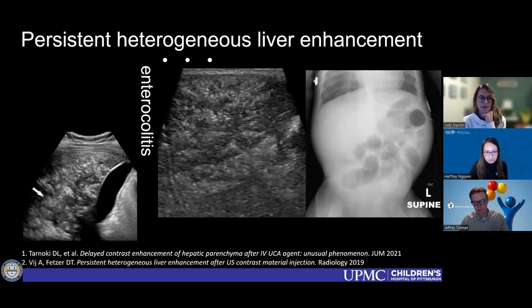But anyway. All right, then a couple more brain ultrasound questions. First, is there any contraindication for brain ultrasound in ultra low weight preemies?